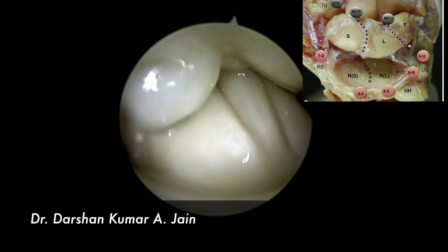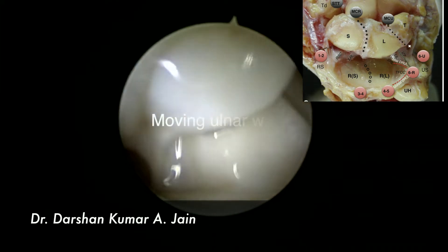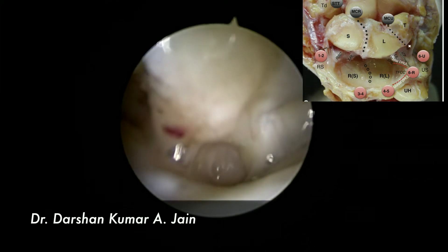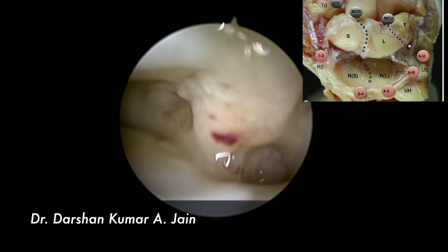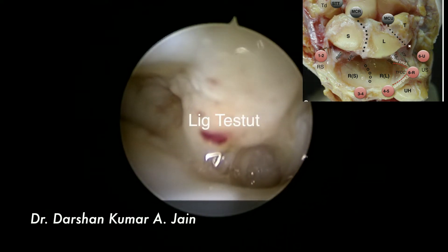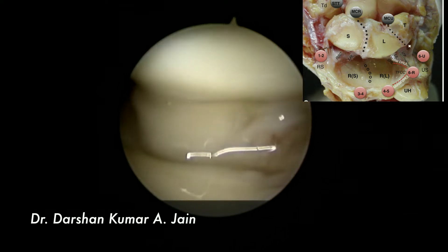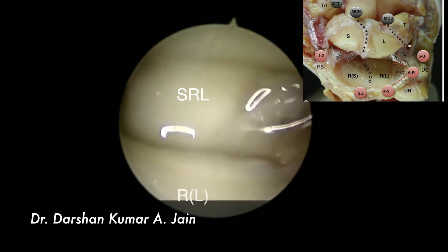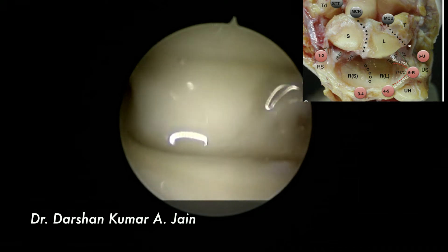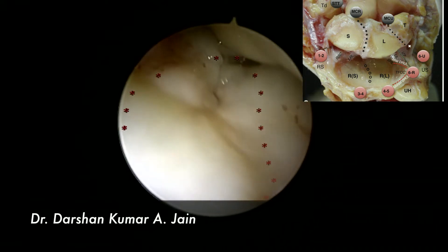Further moving ulnar side, you could see the ligament of Testut, which is a rudimentary ligament identified by the leash of vessels. Further moving ulnarwards, that's the short radiolunate ligament, and the ulnotriquetral and ulnolunate ligament, and this is the TFCC.